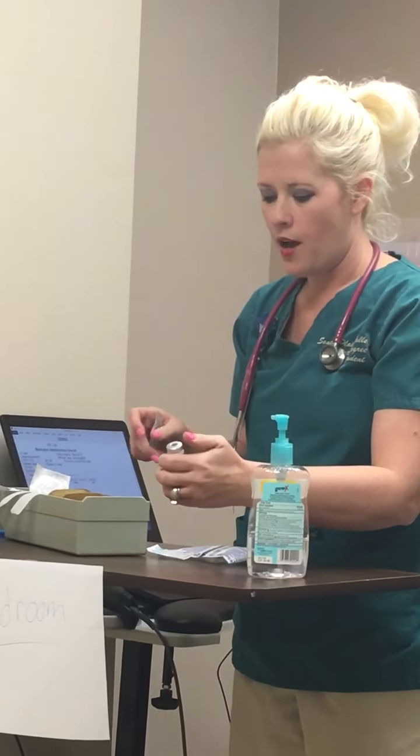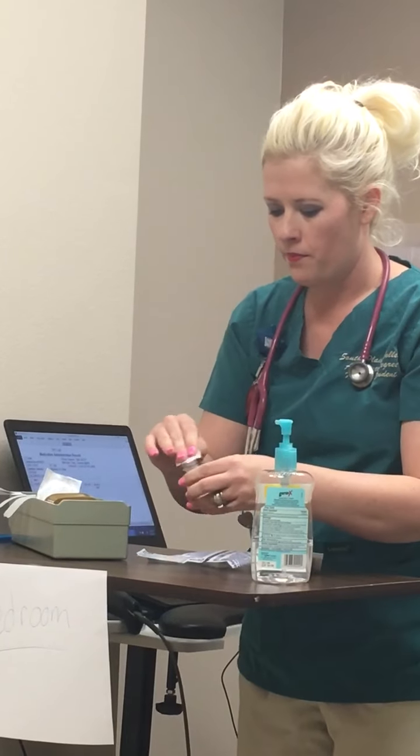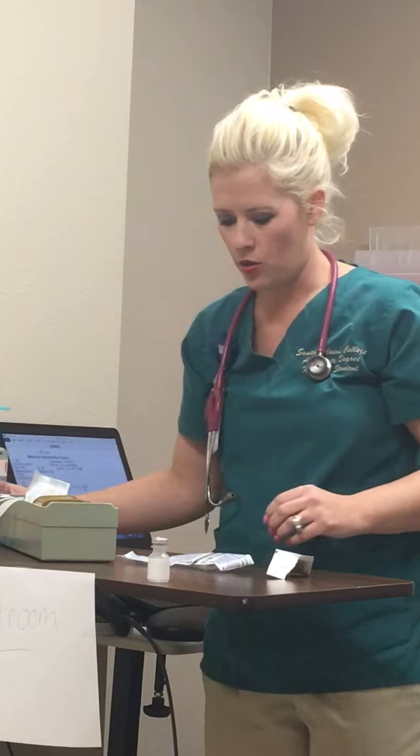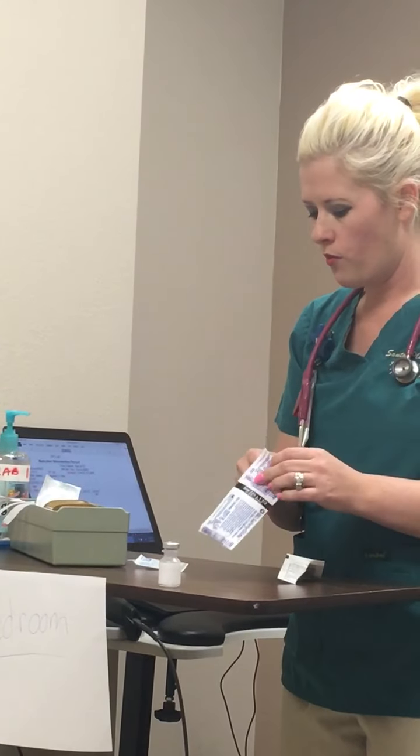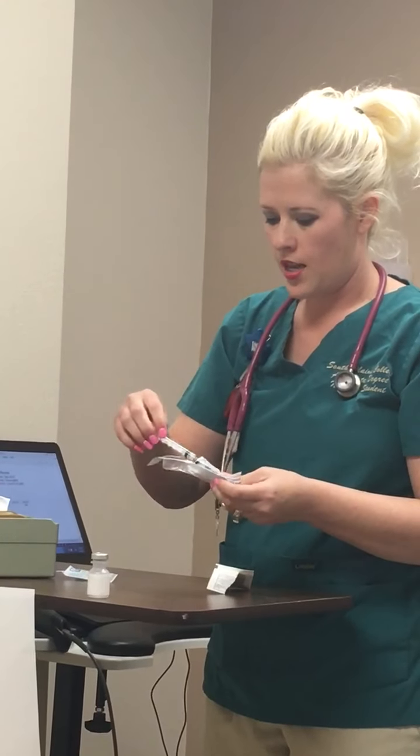I'm going to pop the top. I'm going to go ahead and clean the top of that vial. And I'm going to put it in the corner so I don't knock it over. I'm going to open my syringe and attach the needle.